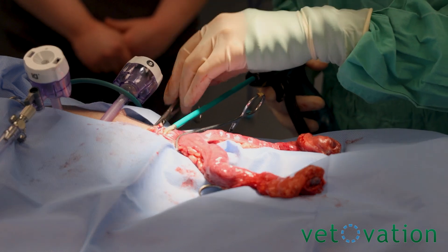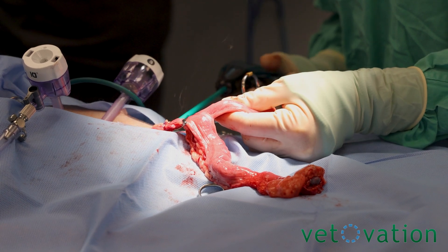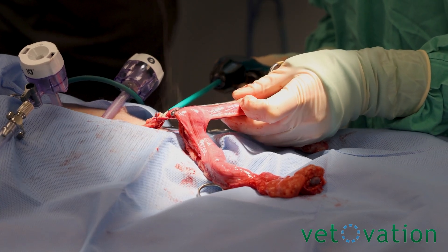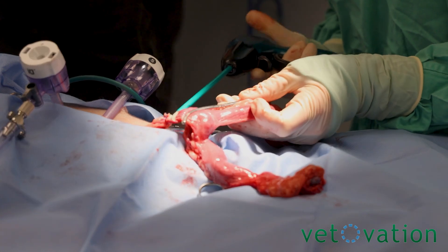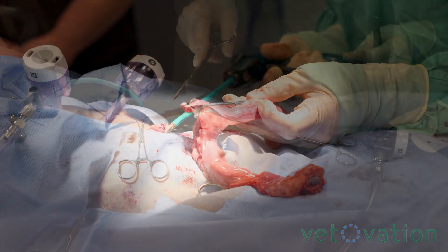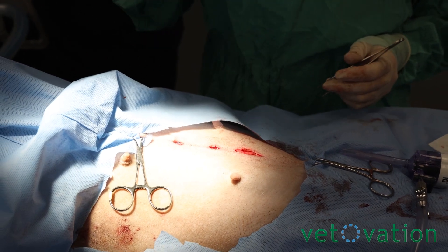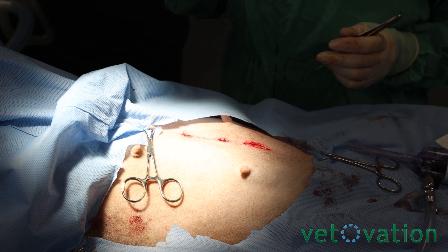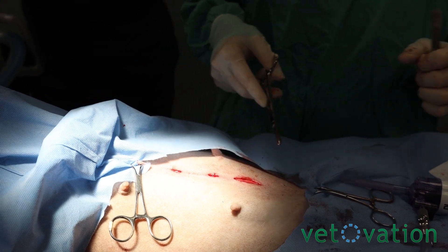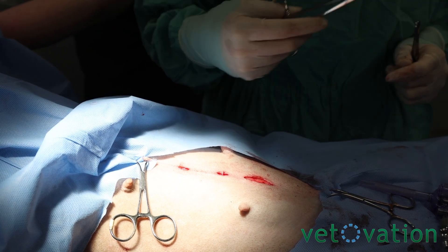We'll tag on the specimen to the cervix side to make sure it doesn't disappear into the abyss behind the bladder. For your typical ports, what I do is grab the linea and do a deep cruciate, then come back and do an intradermal and hide the knot. For this bottom port — which would normally be your cranial one when you do a spay — I would do probably a three-layer closure because it is large, and then do a cruciate on the skin.